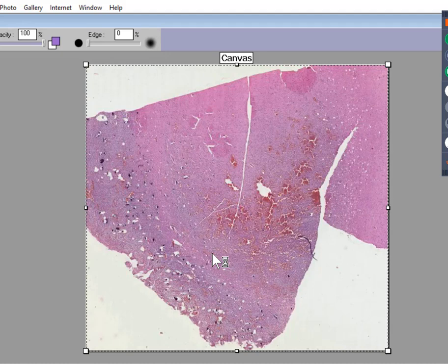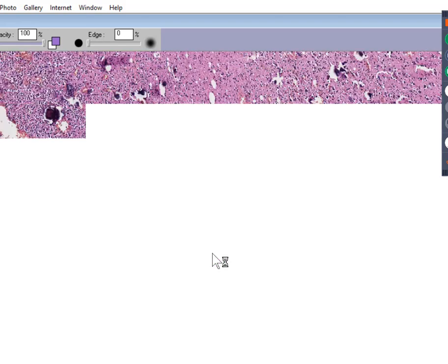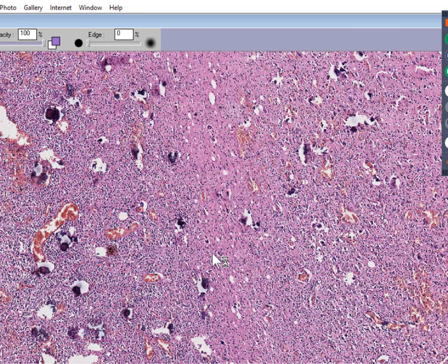And you're going to say, well, this showed up as a mass on CT. Patient had clinical symptoms. We don't know what part of the brain it's from, but it does not look like normal brain. And in addition, another thing you can say almost right away from looking at it, which may have been evident from the CT scan, because the CT scan is very sensitive to calcified areas: there's a lot of little calcifications in this tumor. There's a lot of cells, yeah, but there's a lot of areas where it calcified. So on CT, this may have looked like a very, very calcified tumor.